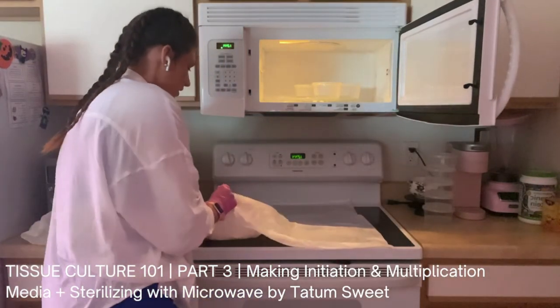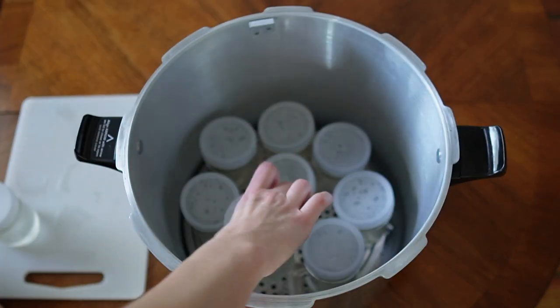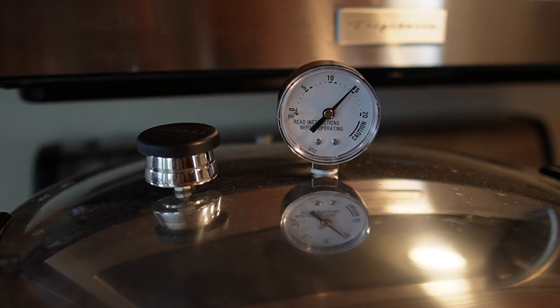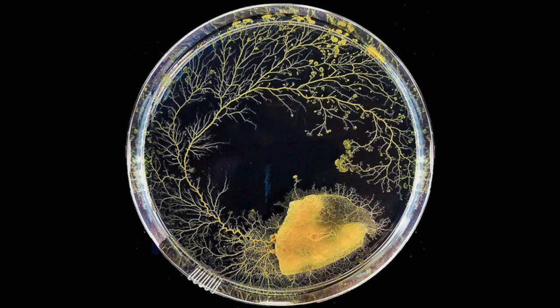Today we are going to talk about how to sterilize tissue culture media by using a pressure cooker. There are two main ways to sterilize tissue culture media at home. The first way is by using a microwave — if you've watched Tatum Sweet's videos you'll know that's how she does it. A lot of people prefer the microwave because it's faster and more convenient. But using a pressure cooker as an autoclave achieves a higher level of sterility, since autoclaving uses steam at high pressure and temperature to kill all microorganisms including spores, which can survive microwave sterilization.